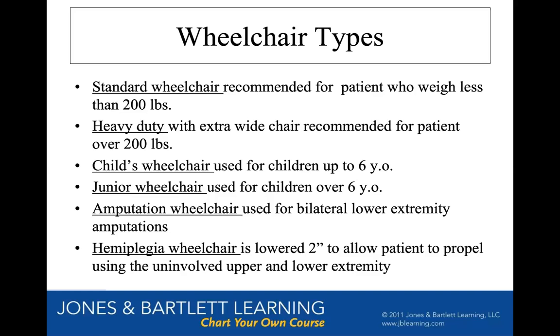Heavy duty is going to be an extra wide wheelchair, for people over 200 pounds. Now, most of the time nowadays, we call those bariatric chairs. And those bariatric chairs, you don't really have to know, you'll know it when you see it, because it will be a super wide chair. It will be a wheelchair that looks like it's wide enough for two regular people to sit in, and it will have big bars. It'll be super heavy duty and look like it can hold a lot of weight, because it has to.